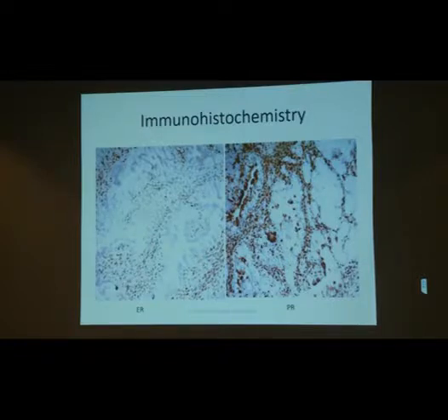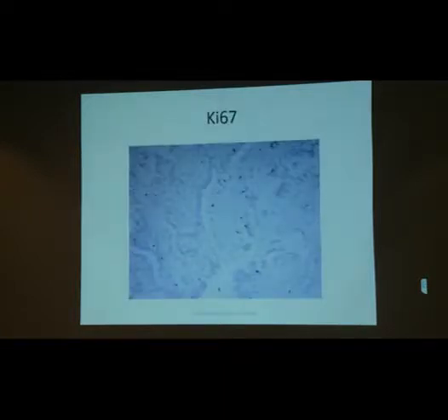Alright, I think everyone's worn out. It's been a long and tiring day. Don't blame you. Okay? CEA, focally positive. Ki67, extremely low.